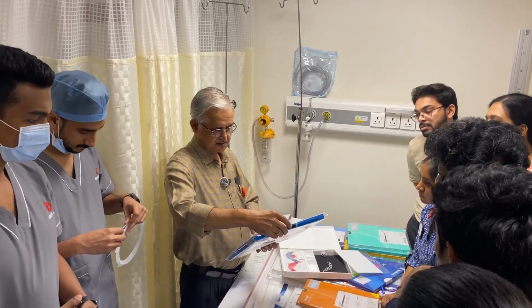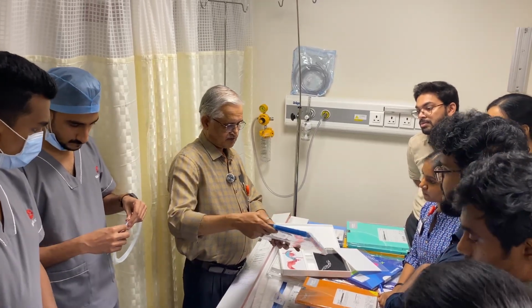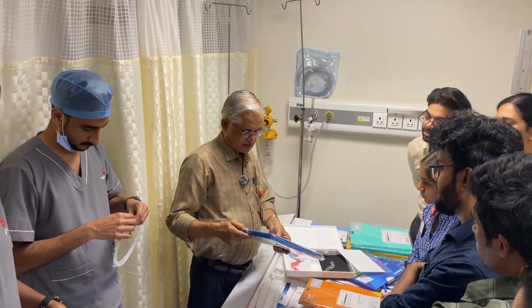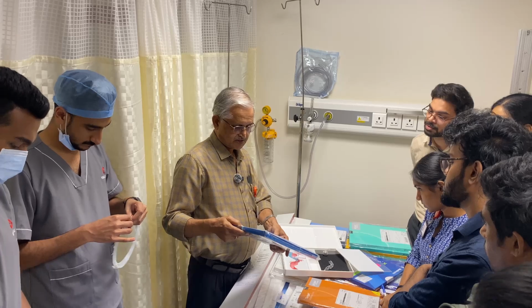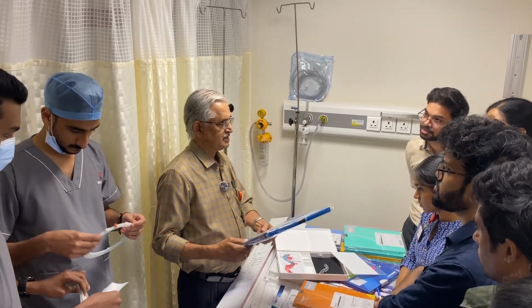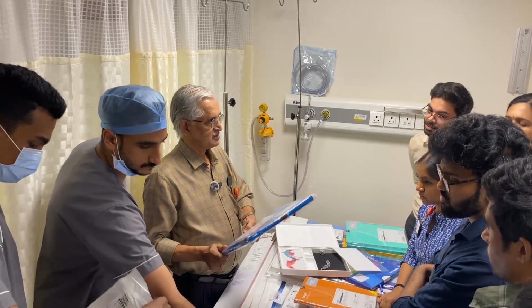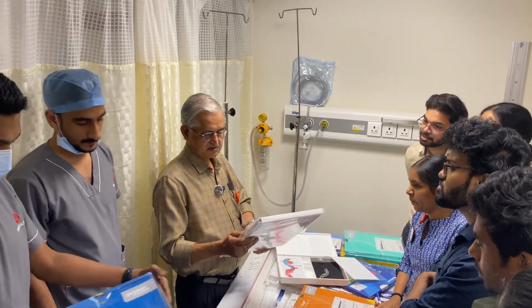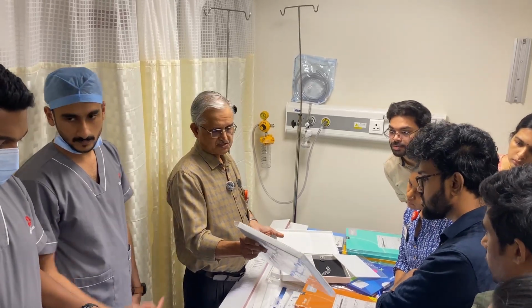Companies are making different things, so every now and then the names will change. So a flow diverter is like this. The important dimensions are the length and the diameter, which are decided by the angiogram and measurement of the vessel during the procedure. There's another device which has come of late. It's being used only for the last 4 or 5 years. It was not previously there.